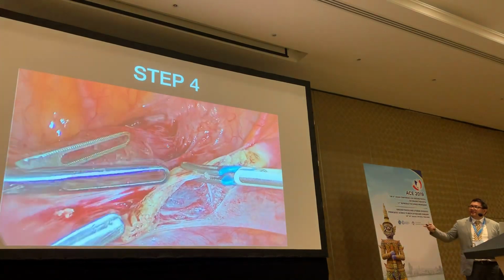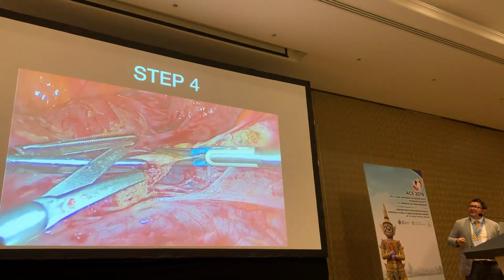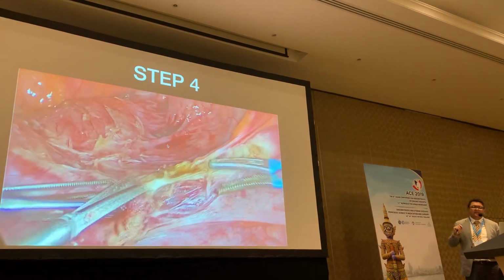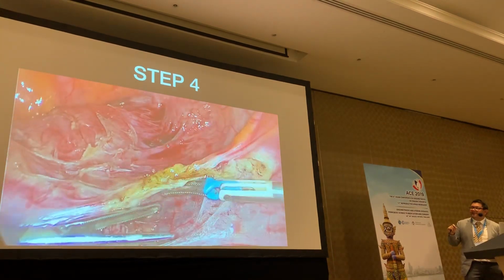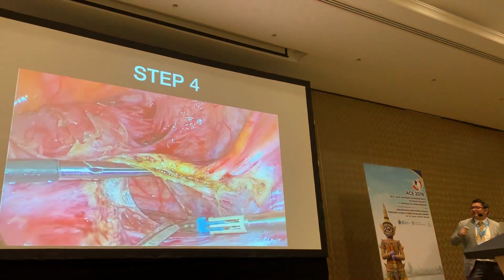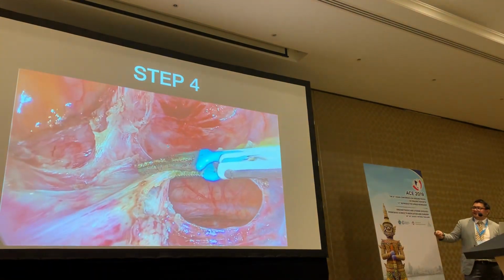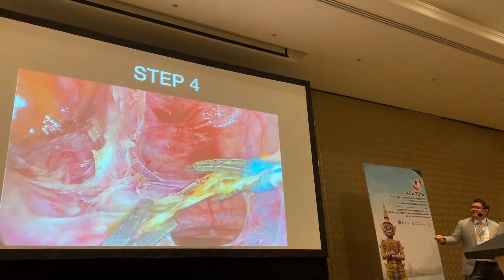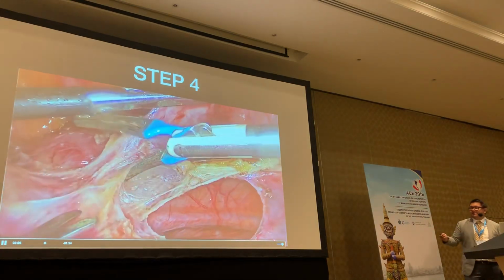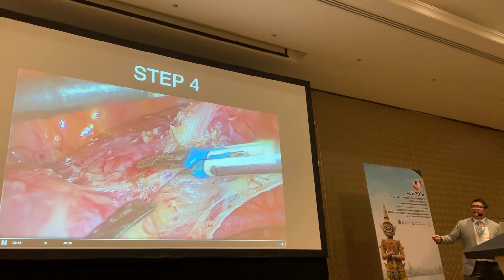So again, continuing, the assistant is using the bipolar to selectively coagulate. You don't need to continuously coagulate into blood, and the important trick to keep your bipolar clean is to open the jaws before you step off the pedal. So that hole that's made once you stretch parallel, this is where you aim for, because the ureter is on the lateral border of this window. So all your dissection has to be medial to this, and you'll never run into the ureter while you're jumping down here till you dissect your bladder away.